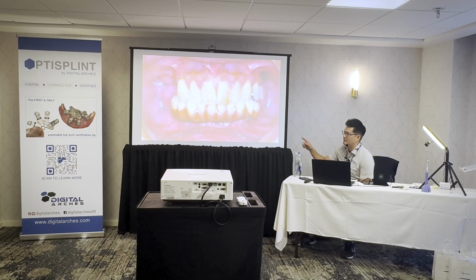Yeah, so in this case, that could have been a problem. Every time I do angled abutments, you need to torque down the multi-units. You're right, because if it's a 30-degree multi-unit, sometimes they'll torque it down and feel like it's 35, but it's hitting against bone, and then that bone remodels and leaves a gap, and then that multi-unit is loose by one or two threads.